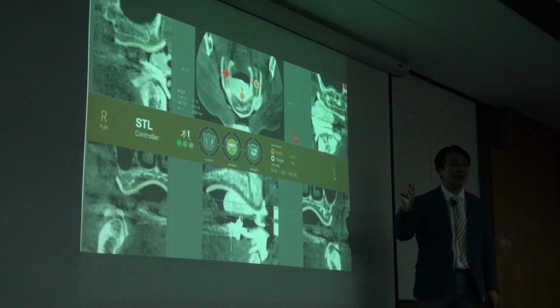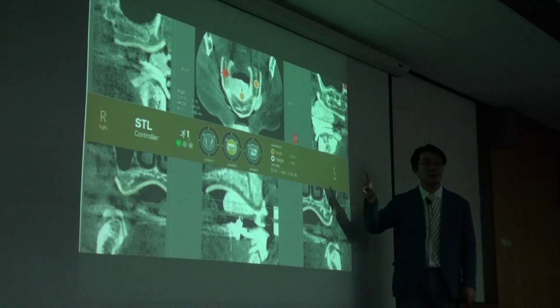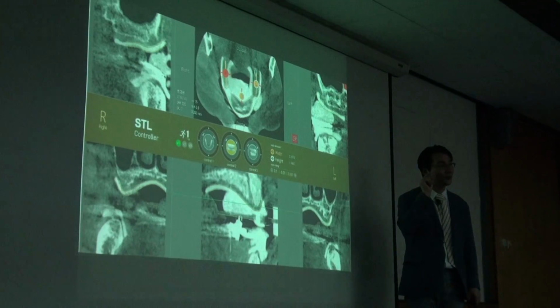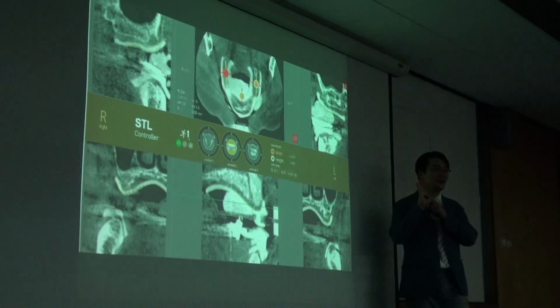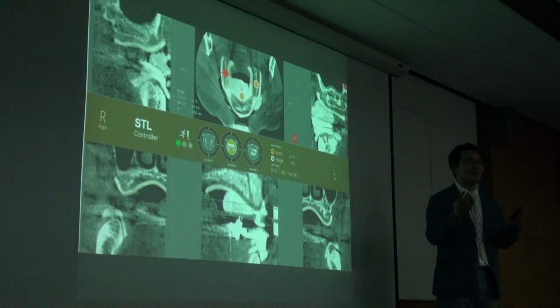So it means we have to examine the CBCT images. CBCT has some limitations. You have to remember. Originally CBCT is a fake illusion, and the volumetry of CBCT is not stable. It's a very important thing.